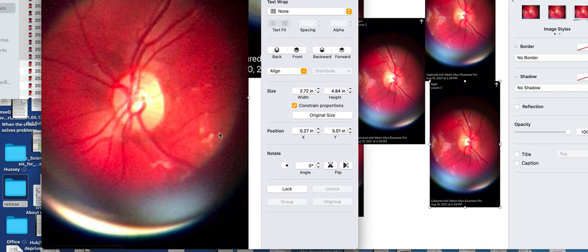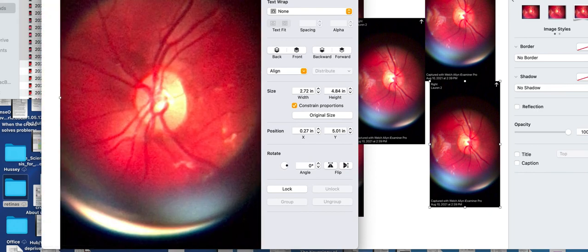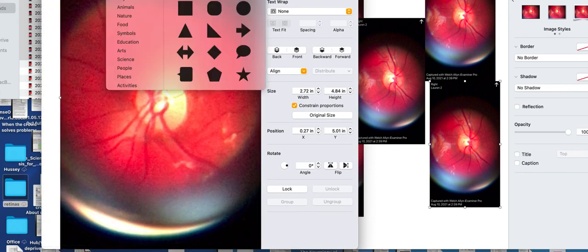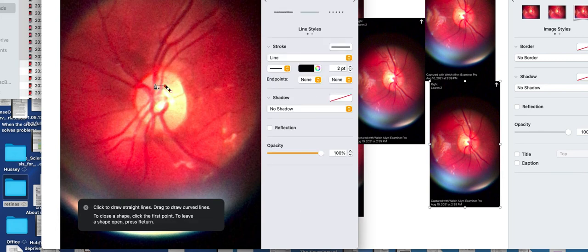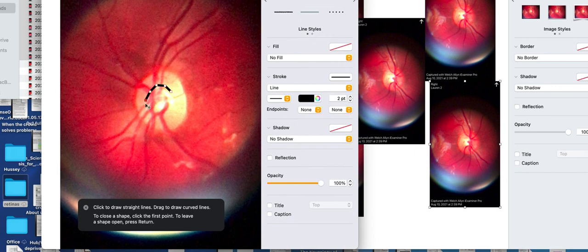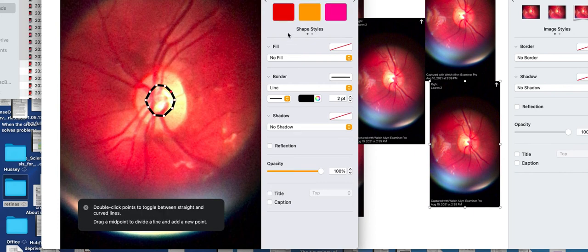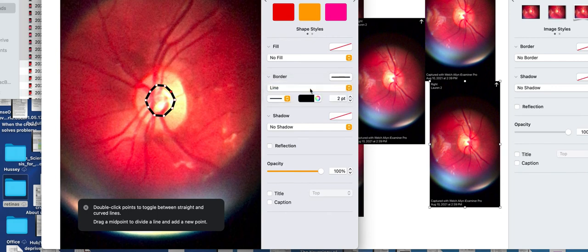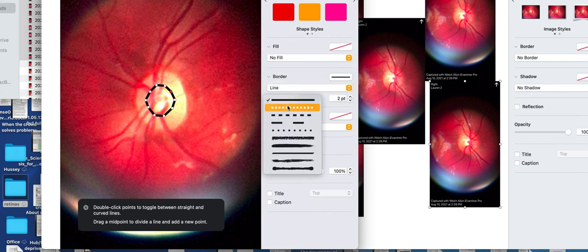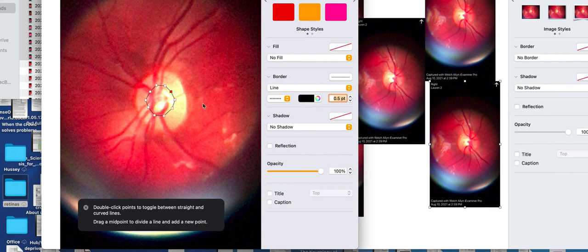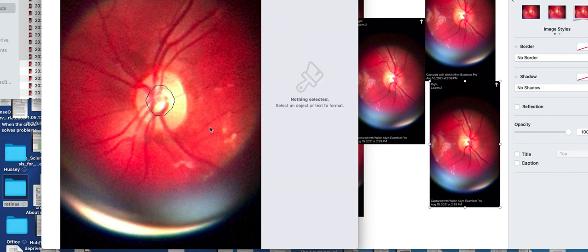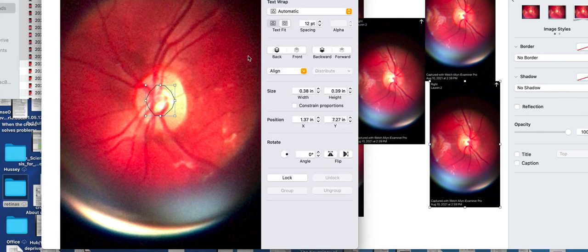This is way blown up. I'm going to take my marking tool here in my Pages program, and I'm just going to draw a circle around the cup. Perfect? No. Let's be real. I usually make it dotted and I make it a little smaller. Now I've got a rough outline of the cup. Perfect? No. But it's something that I can track over time.